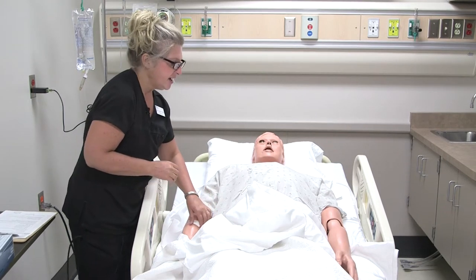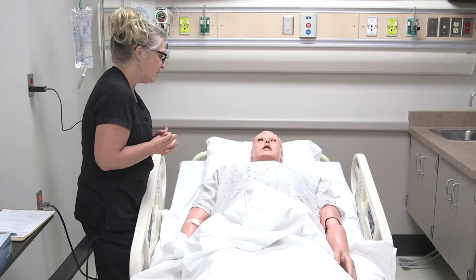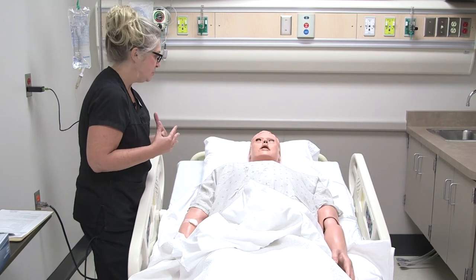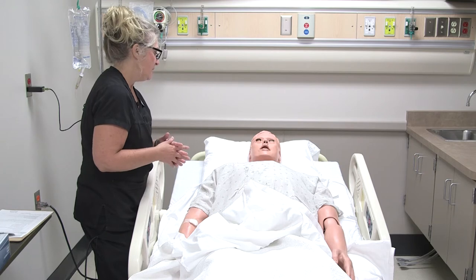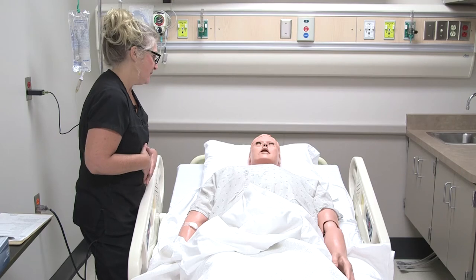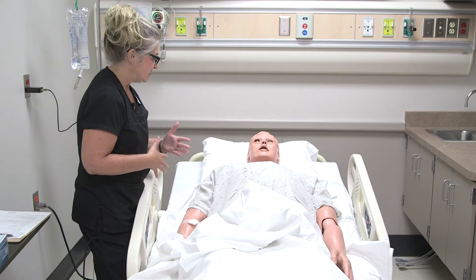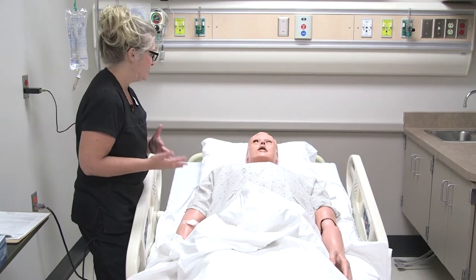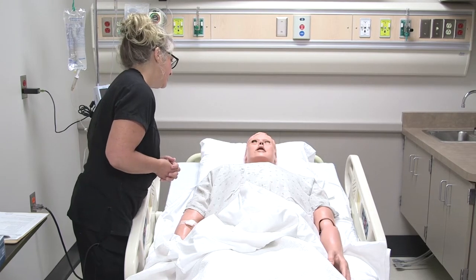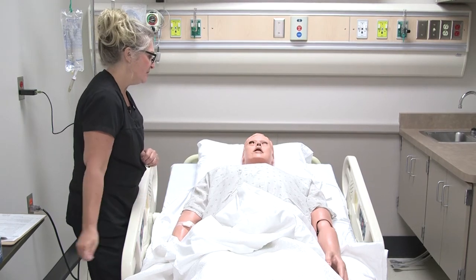All right. So Tim, I am here because your physician has ordered us to put in what we call an indwelling or Foley catheter. This is a tube that will help you drain the urine that you have in your bladder right now, because I know you're becoming very uncomfortable because of your bladder being so full. We tried to assist you with that by other means, but it hasn't worked. So the provider does want you to have what we call an indwelling catheter. Okay. Have you ever had one of those before?